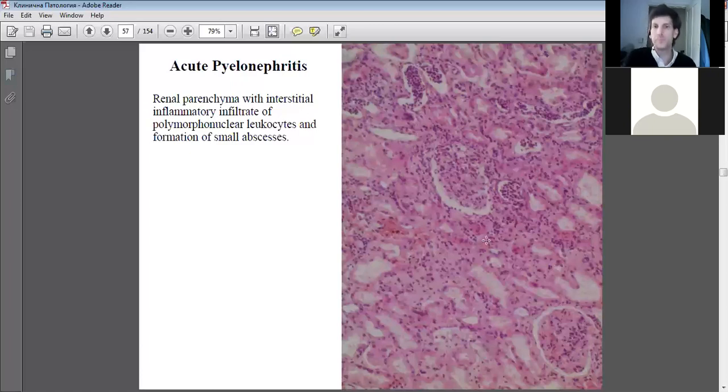So the darker colored ones are the leukocytes. Some of them, yeah, not all of them. We'd have to have a higher magnification, but they're dotted inside there. Some are the macrophages, some are the leukocytes. You'd probably need 1,000 or 1,500 times magnification to see them.